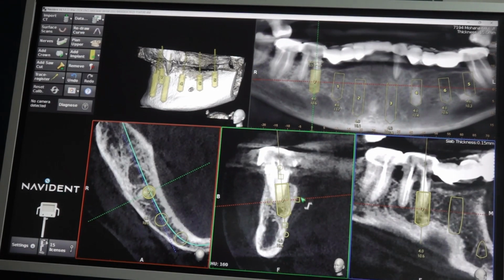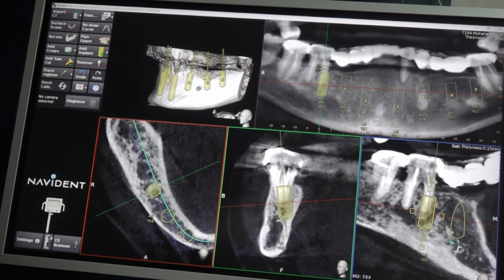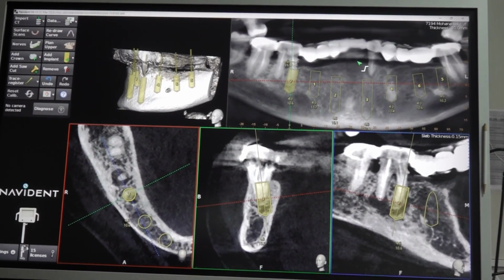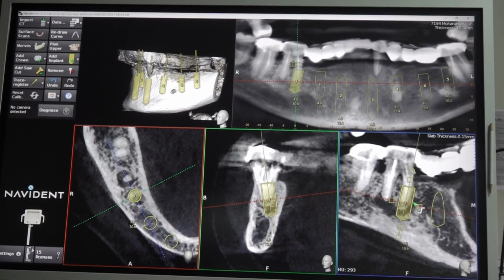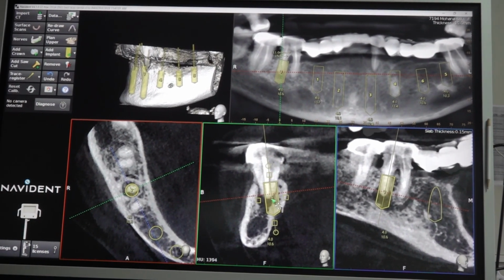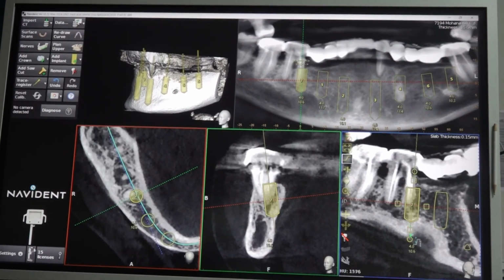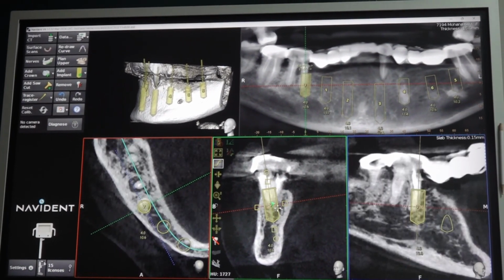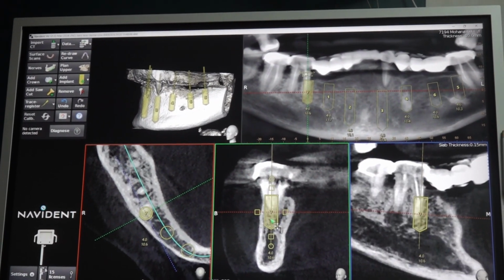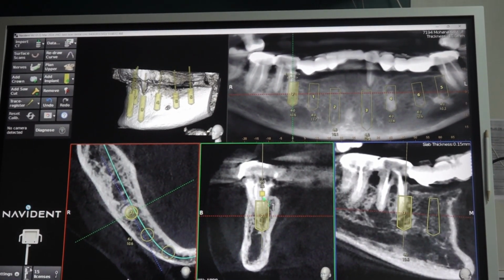So we will check the mesial root. See, somehow because the force is going through this 6, the bone quality is good. Anteriorly, no tooth, no work, no bone. Here, some work is going, so the bone quality is good. But because of periapical infection here, there is a cyst here. So either we can choose the mesial, yes, 4-6. But we don't know which canal. Yes, this is the canal, right? Maybe a very short implant we can place, 8 something.